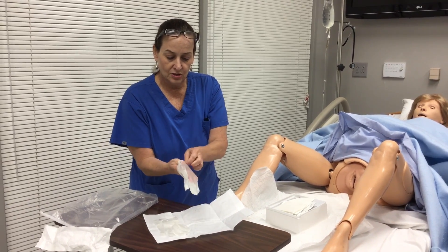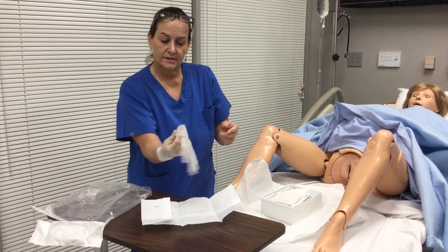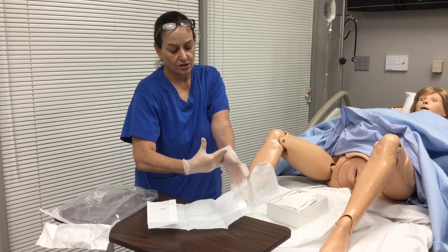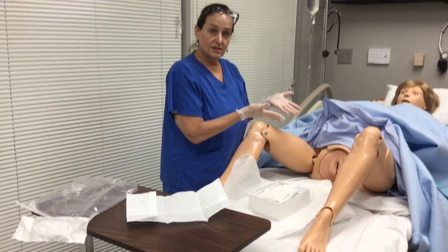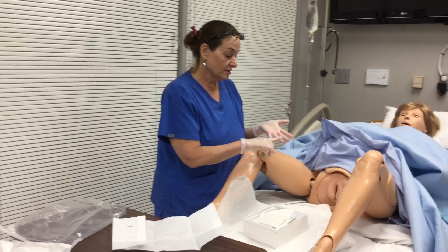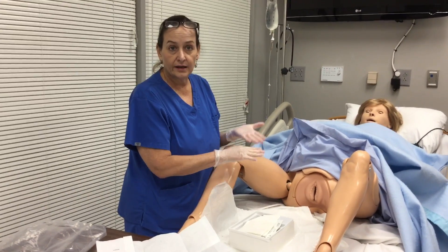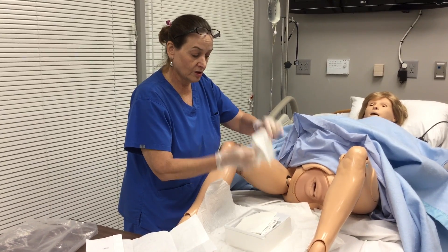We're going to open up our gloves. I usually put my dominant hand on first — slide your hand in without touching your hand. Ask your patient if she's allergic to anything, particularly iodine or latex. Many of the kits are latex-free now — I know at the facility where I am everything is latex-free — but you want to verify that with her.